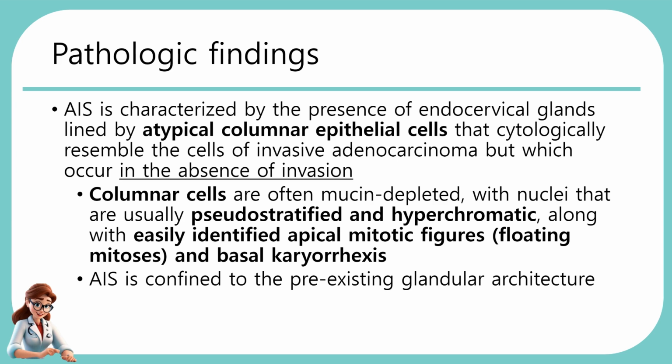AIS is confined to the pre-existing glandular architecture, therefore retaining a lobular architecture. This absence of stromal invasion draws a line between an AIS and an adenocarcinoma.